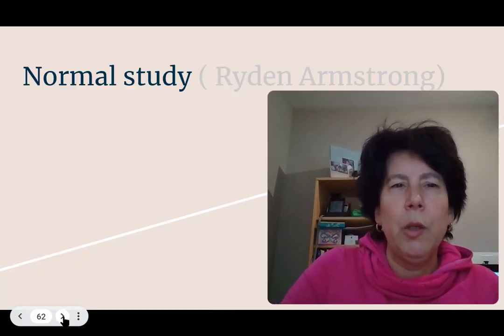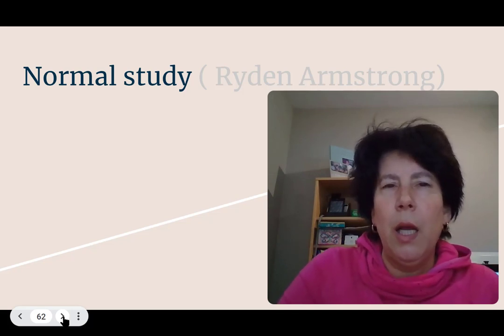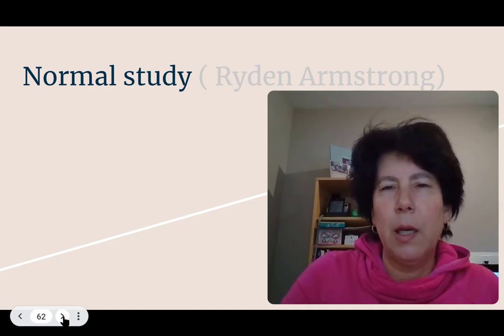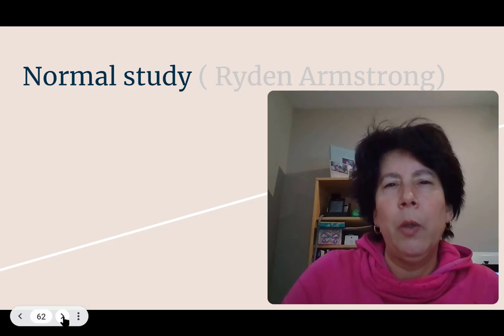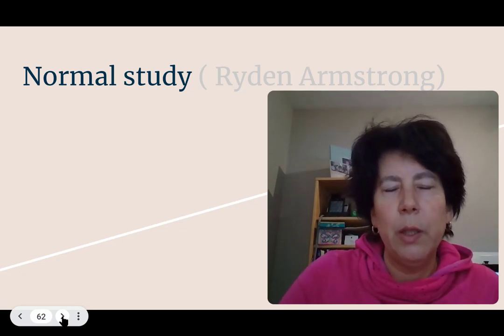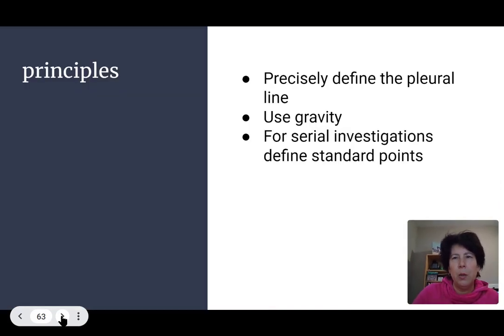So we're going to show you an example of one normal study that Ryden did. So this is not the perfect study, and the point of this was to show you that different patients have, you know, again, different quality imaging. So it's not always textbook, but I want to get you a sense of what the expectation is, what you should record when you come into our program, and what a full normal study would look like for us in anesthesia. So please remember to precisely define your pleural line.